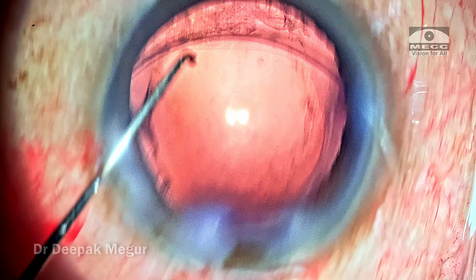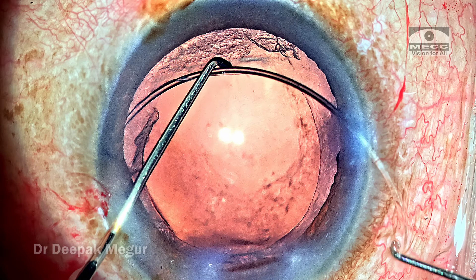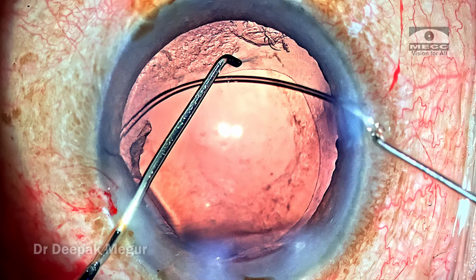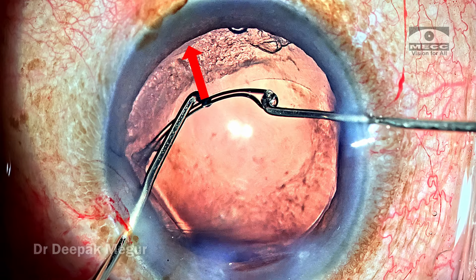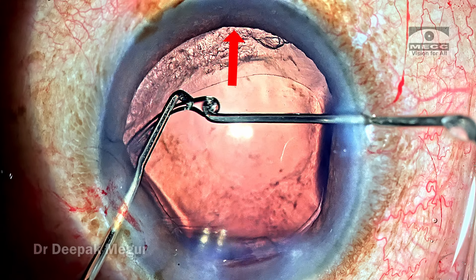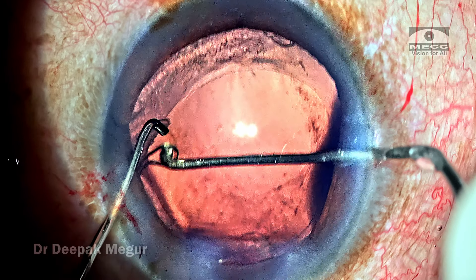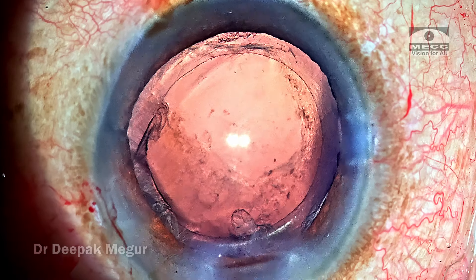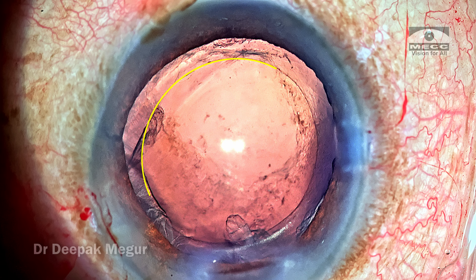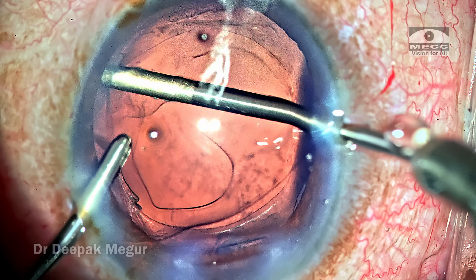I'm suspecting zonular weakness in the distal part around the three o'clock region — I'm sitting at the temporal position. I carefully ensure the CTR is placed well beyond that area. Immediately once the CTR is inserted, the shape of the rhexis margin opening also changes back. It was a sigh of relief and I felt it was the right step.